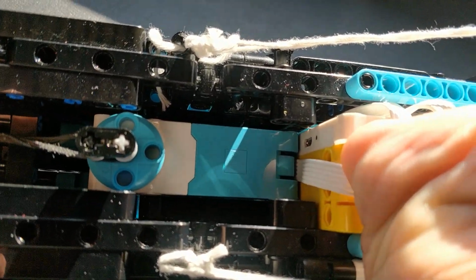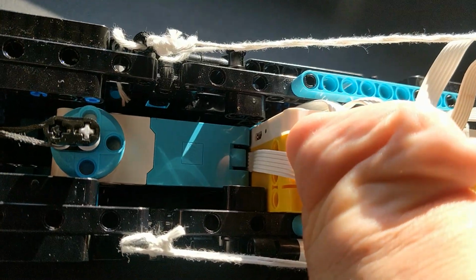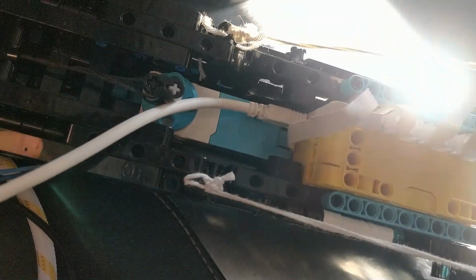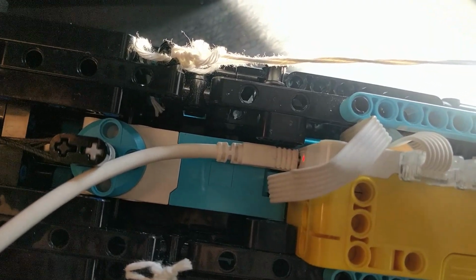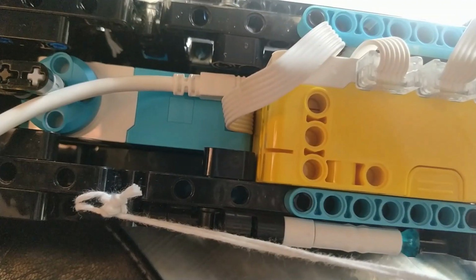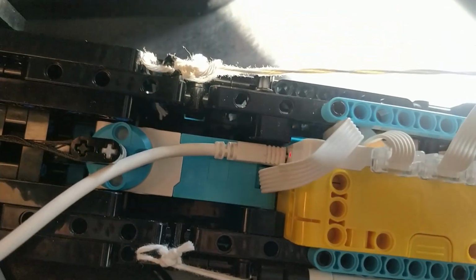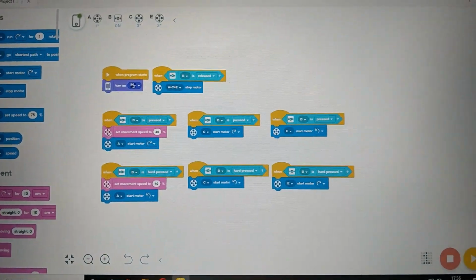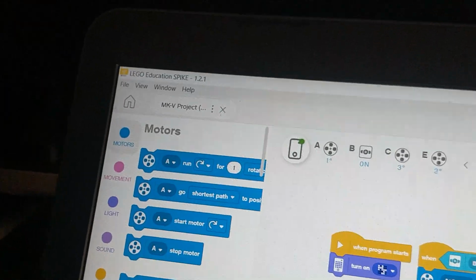Okay, once we're done building this part of the prosthetic, we need to grab this cable and jump onto our computer. In order to connect the hub to the computer, we need to grab the cable that comes in the box of the Spike Prime set and connect this small micro USB connection to the computer. Once you connect the hub to the computer, a red light should appear right here, and you don't need to worry about breaking the USB port right here, because it fits perfectly. I actually was very lucky to build this in this way. So let's jump into the computer and explain what everything does and how to activate the prosthetic with this software that's called Lego Education Spike.